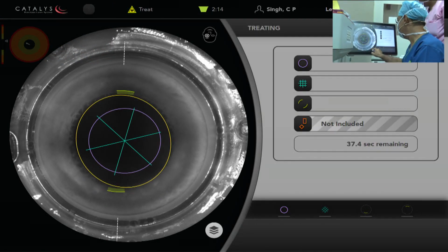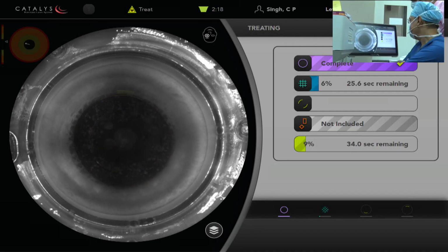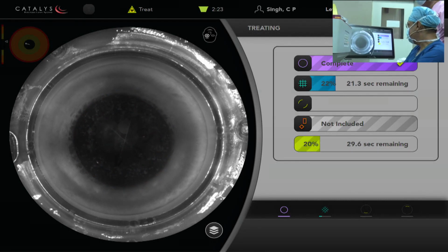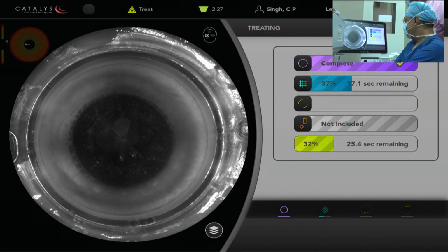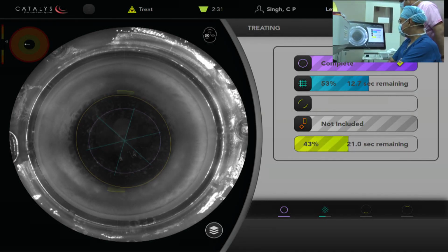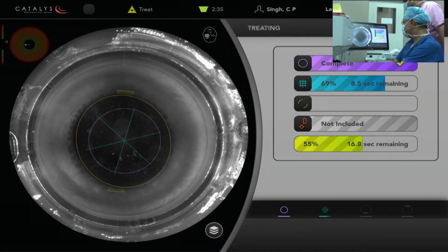Now keep watching here in the middle. I'm starting to fire. The rexis will form in about 1 second. It's complete. And now we are doing the 6 quadrant cracks for the gentleman. And after this, right after my case, Dr. Rishi Swarup is going to show you his toric IOL implantation. He's come here all the way from Hyderabad on a river rafting trip.